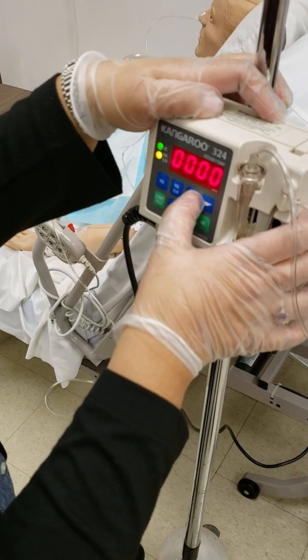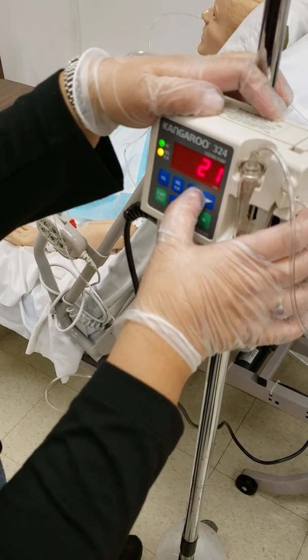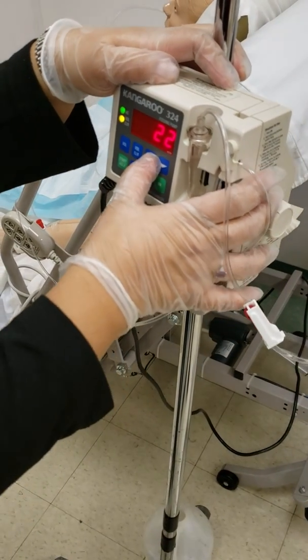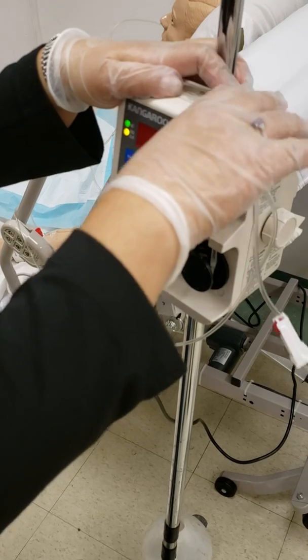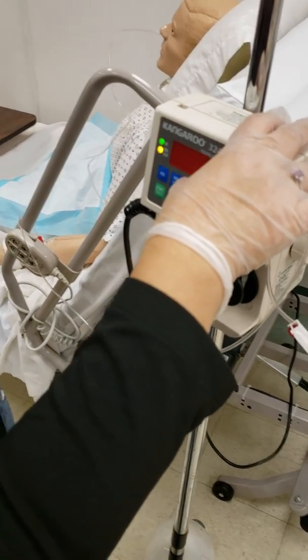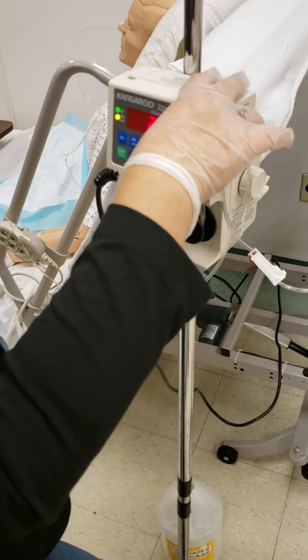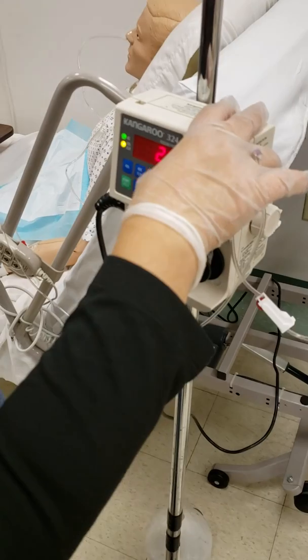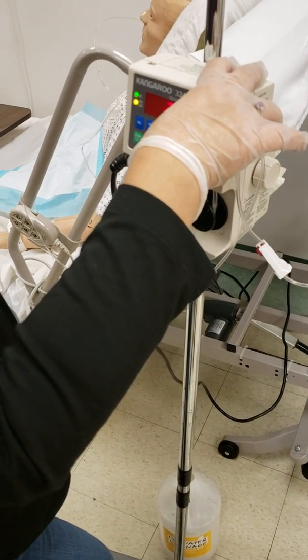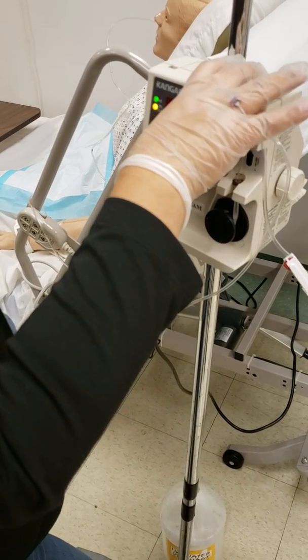I forgot the order. I'm gonna tell you only a few mLs per hour. Usually it's like 80. I think they only gave 20 or something. 20 ml per hour. I'm gonna check.